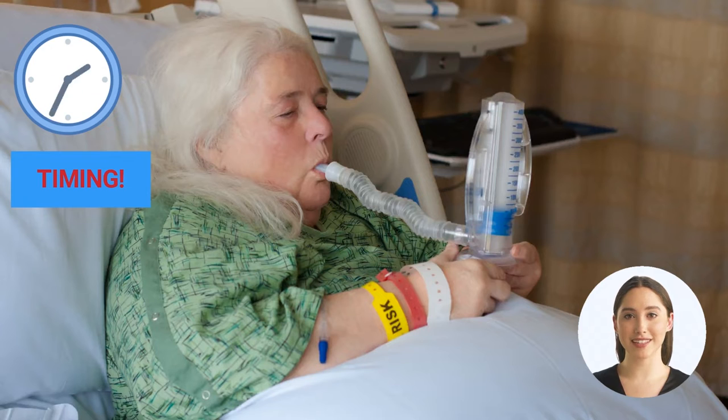Tell the patient to use the IS 10 times each hour while they are awake, or, if there is a goal value ordered, to try to meet the goal set by the MD. Ensure the patient has a pen and paper to record their values.